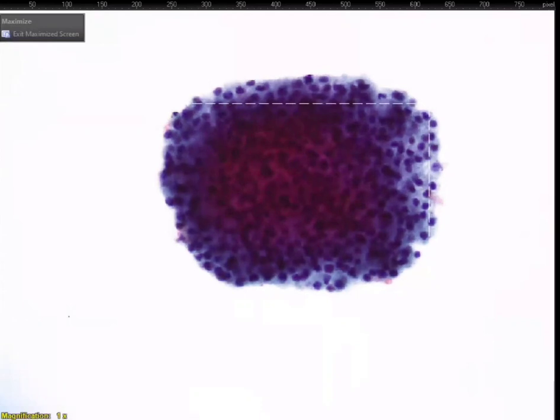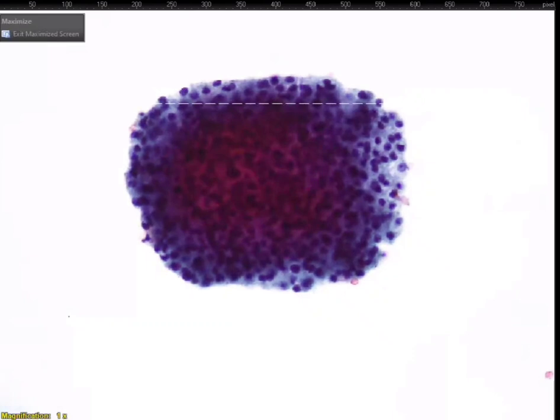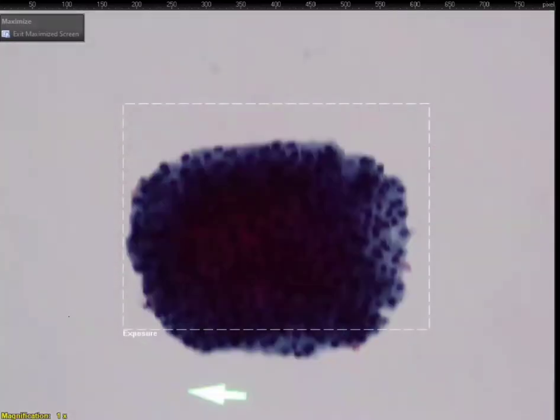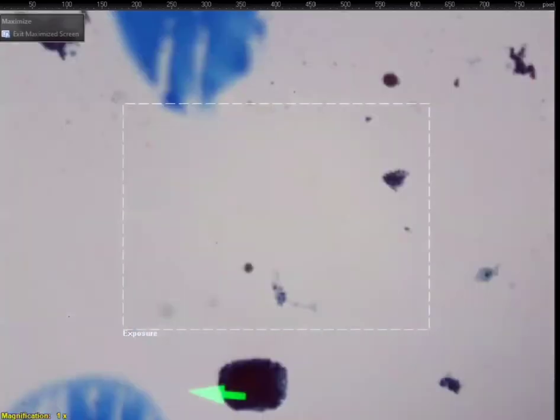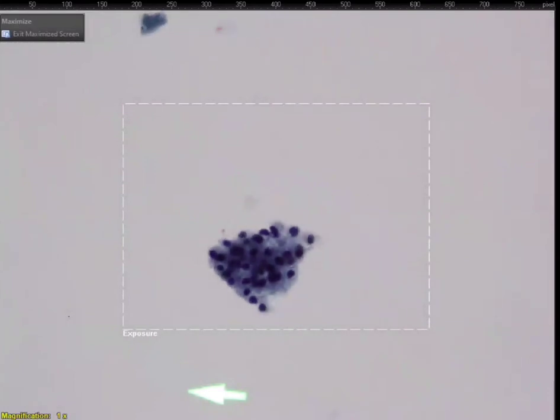Is there a particular location these papillary neoplasms can come from? This is 4L, so it's mediastinal. Pancreas, pseudopapillary neoplasm of the pancreas. Can it metastasize? Okay, one option. Anywhere else? Thyroid. Yes, that's another one. They get papillary neoplasms, and this is nearby, right? Paratracheal.